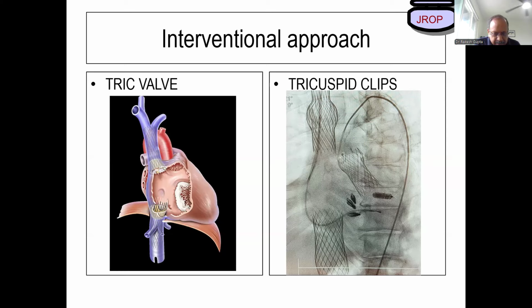Today, I had an echo of a patient admitted with AMI. He was in shock. He was having inferior wall plus true posterior wall infarction. But when I went to round, he was having cold extremities, but BP was showing 110 like that. The patient was having some hypoxic behavior. He was anxious and talking irrelevantly.